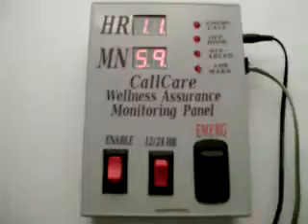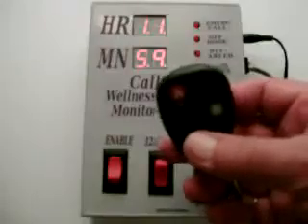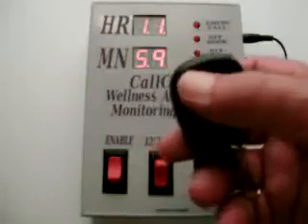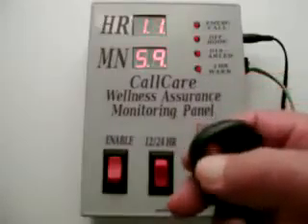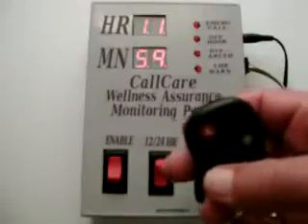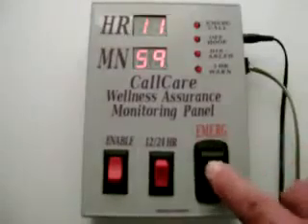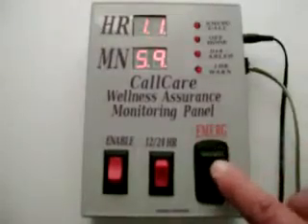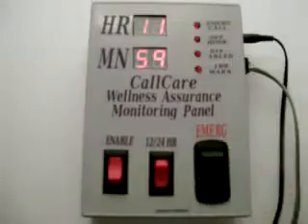The third switch initiates the emergency call in the same way that the RF pendant can initiate an emergency call with its A button. To prevent the erroneous sending of an emergency phone call, the A button on the pendant and the emergency call button on the panel must be held down for at least 1 second before it can initiate the emergency call sequence.